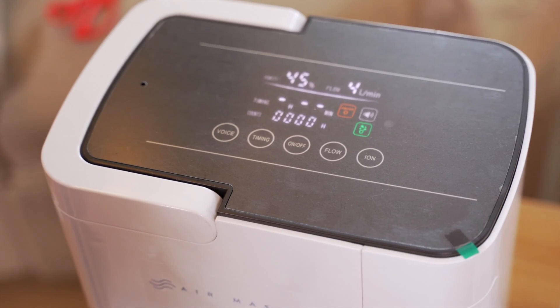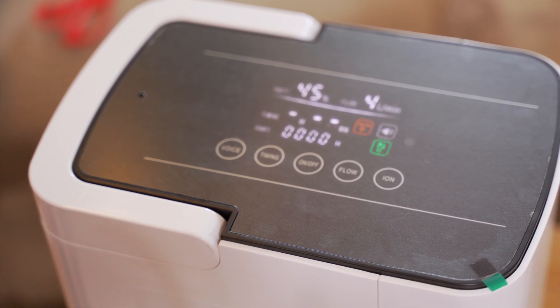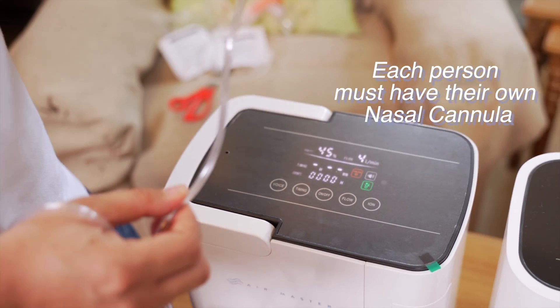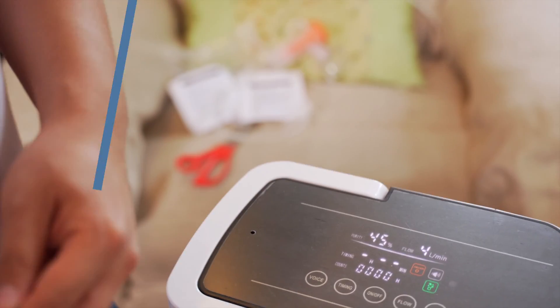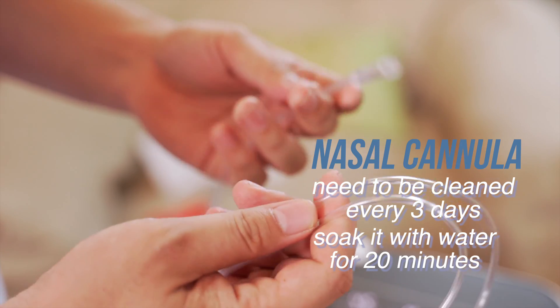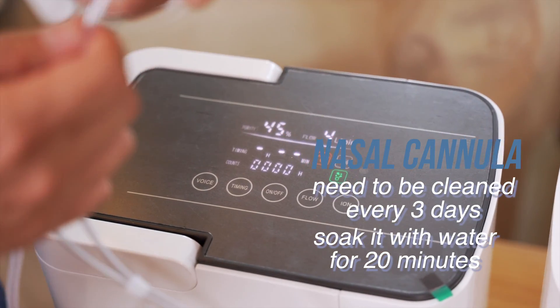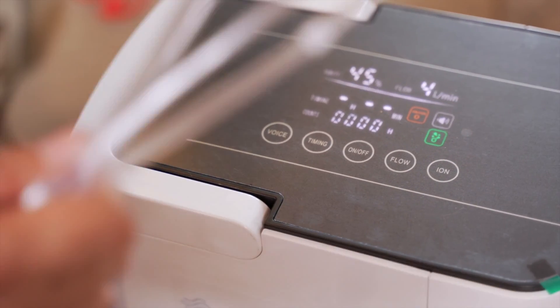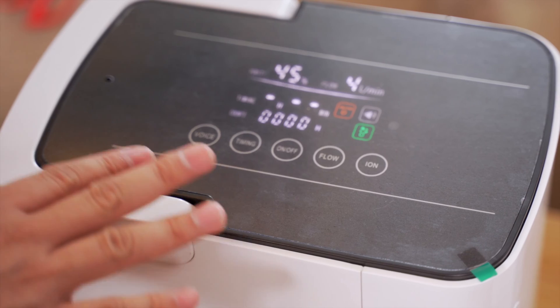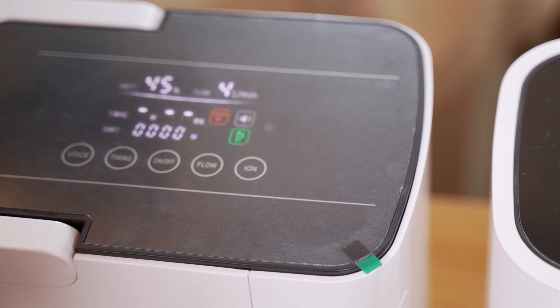Next, we'll discuss the maintenance of this unit. Make sure that each person has their own nasal cannula — you cannot share the nasal cannula with another patient. You have to clean it at least every 3 days by soaking it in water for 20 minutes. For the machine, just wipe it with a damp cloth. Don't put any chemicals, Lysol, or any disinfectant — just damp water.